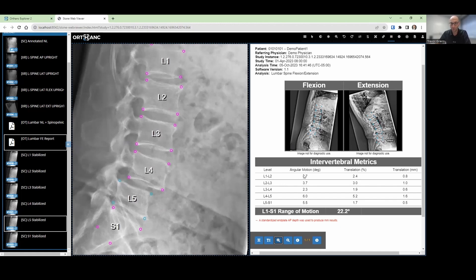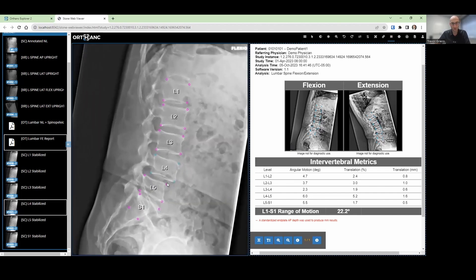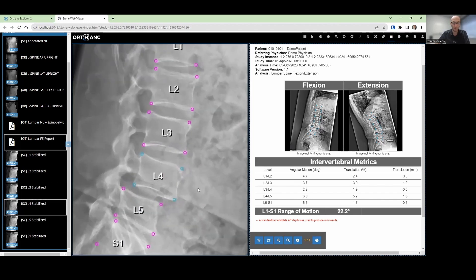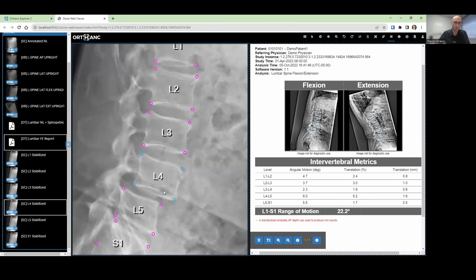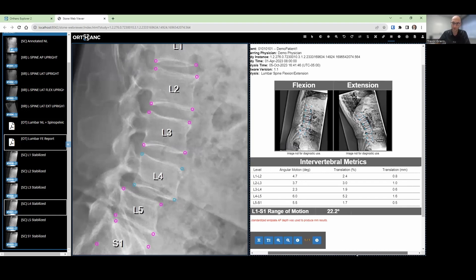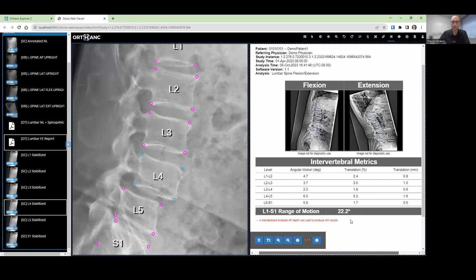We actually report on motion at every single level and stabilize all the bodies. So we could pull in an L4 stabilized series and look at the quality of motion above and below L4. You can see the motion at L3-L4 right there, as well as the motion at L4-L5 very clearly. And again, it is all quantified — angular motion, translational motion, in percent as well as in millimeters. These are customizable metrics that are objective, reliable, fully automated, and available at the click of a button.